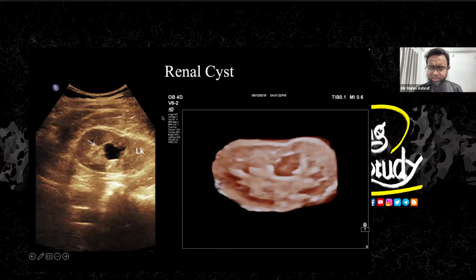Here's a renal cyst. I sometimes get confused about the parapelvic and peripelvic ones. So this cystic area looks like a parapelvic one, but when we put 3D over it, now you can see the cystic area comes from the medullary part, that is the peripelvic cyst. So you can locate the lesion with the 3D ultrasound, because you can change the slice. You have taken the whole volumetric data and you can choose whatever you like.